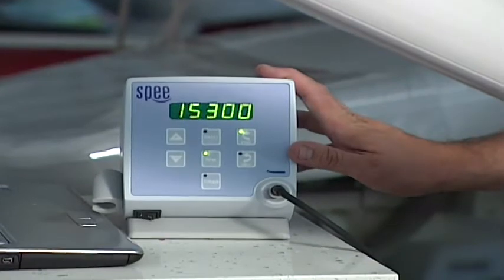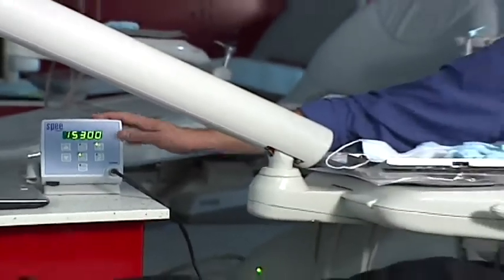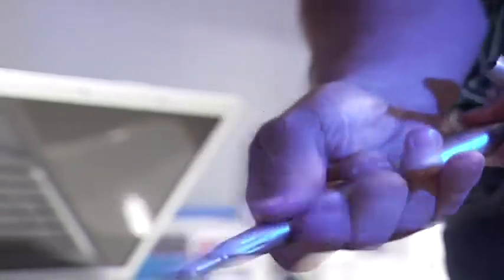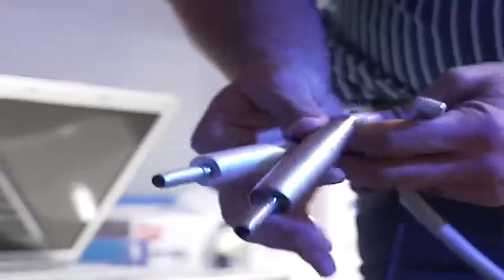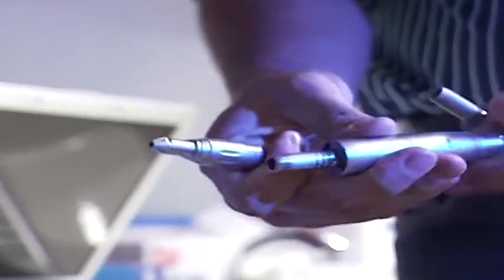We use an electric motor manufactured by a company named SPEE. It delivers power to this handpiece, called a reducing handpiece, that snaps into the motor via an E-connection — a standard, universal connection that all motors in dentistry use to snap into their handpieces.